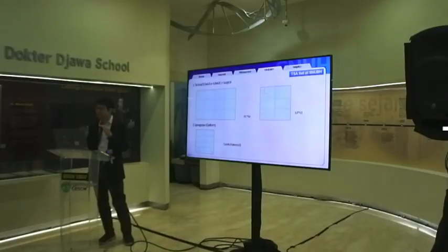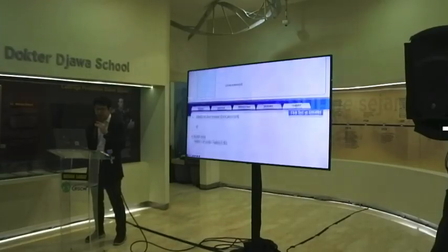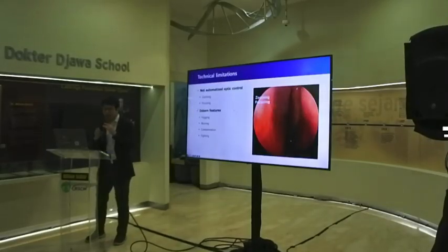I heard that Tachosil is not available in Indonesia yet, but maybe in the future you will get used to this kind of Tachosil, because Floseal and Tachosil are very useful to handle venous bleeding. And the navigation stand, okay.